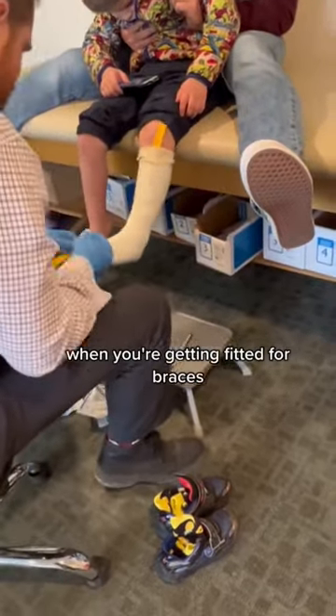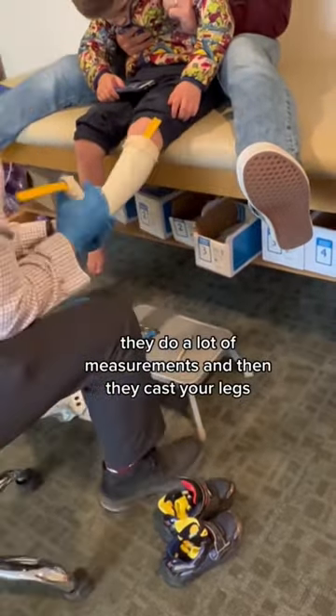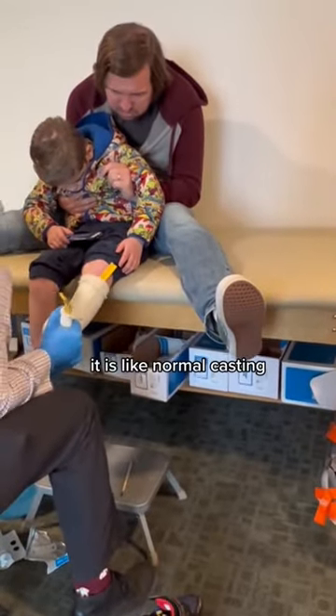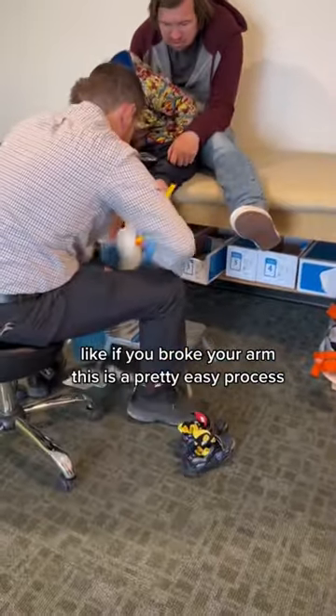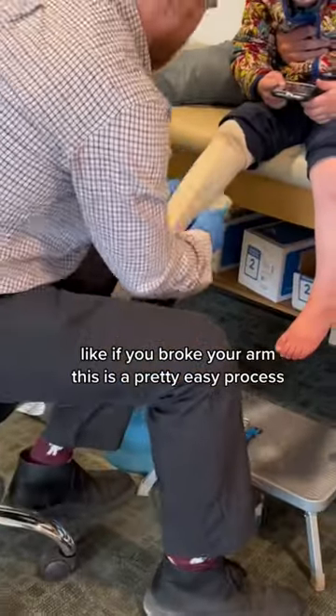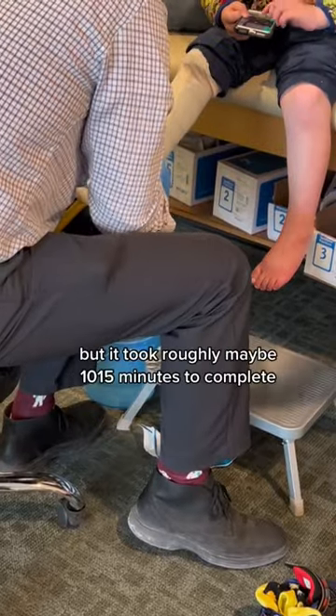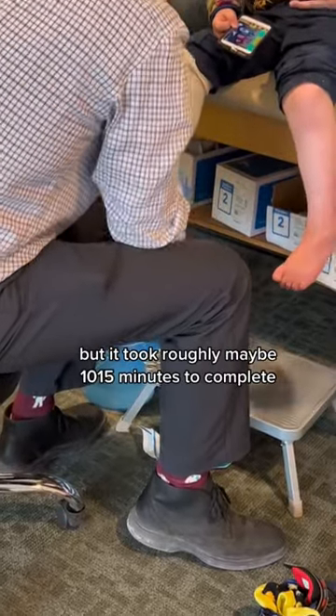When you're getting fitted for braces, they do a lot of measurements and then they cast your legs. So Griffin is getting casted right now — it is like normal casting, like if you broke your arm. This is a pretty easy process. Griffin definitely needed his dad to hold him, but it took roughly maybe 10 to 15 minutes to complete.